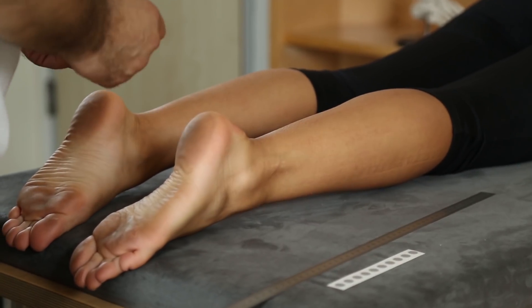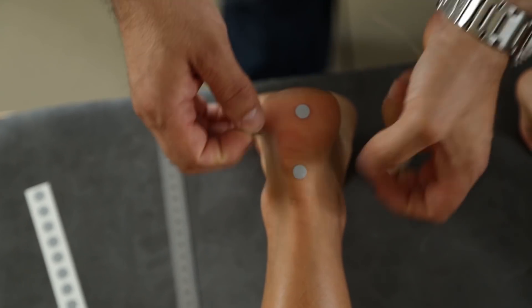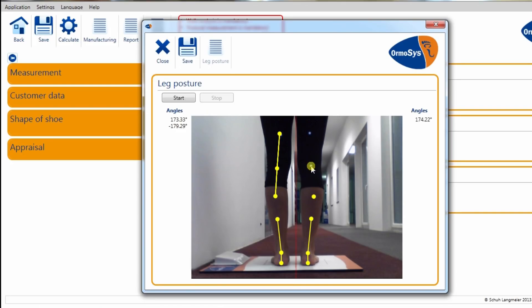The position of leg and ankle joint axis can be surveyed by putting marker points on thighs and lower legs, then filming and finally analyzing them. The software processes the data, and the exact angle of leg and ankle joint axis can be visualized.